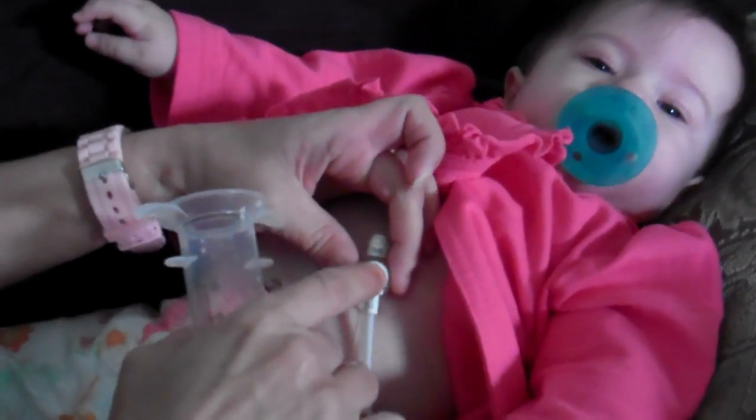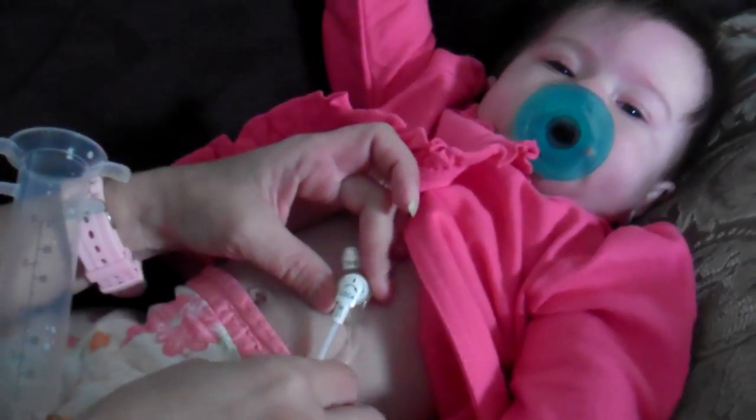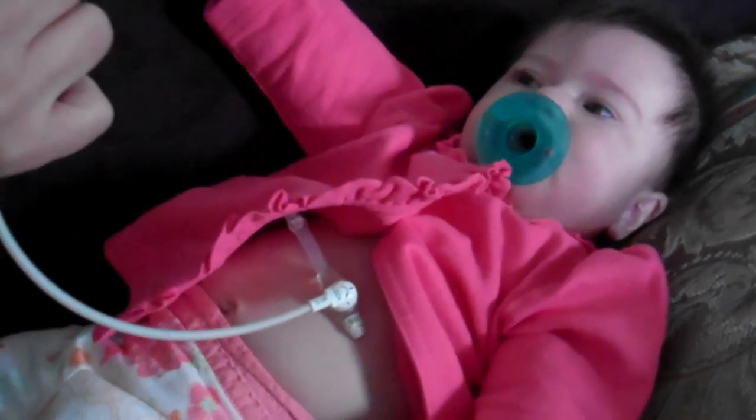You're not going to hurt baby. It's good to use both hands. This one's holding on, that one's pushing in. Then you turn it 3/4 of the way around. Really easy. You'll learn to do this with one hand if you have to. Make sure that is still clamped, and make sure that is pressed down.